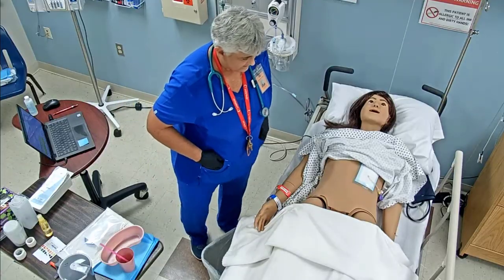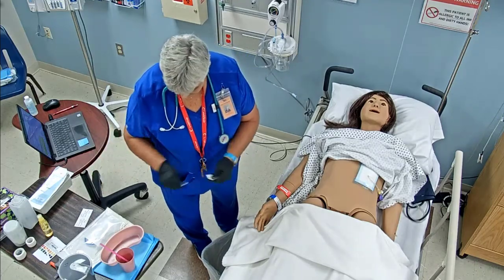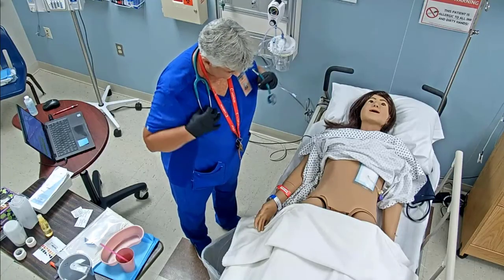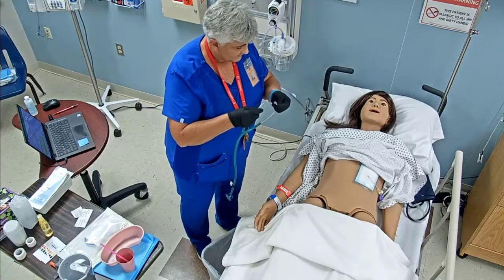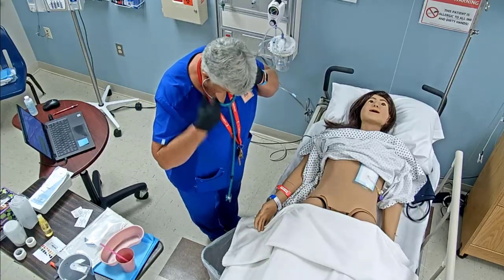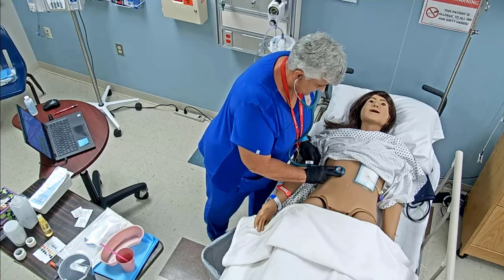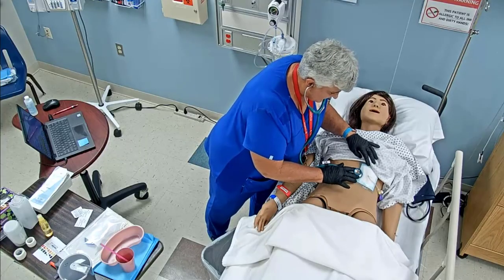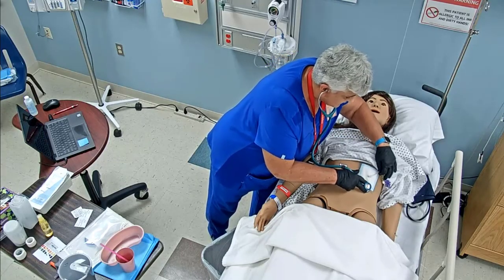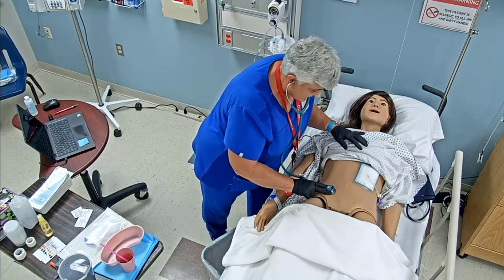with that, I'm going to go ahead and get me some alcohol swabs. A couple of those. I'm going to clean my stethoscope. So we've inspected, and I noted that you're not really having any problems breathing, you're not coughing or anything like that. We're going to listen to all 4 quadrants, making sure we look at the umbilicus as I listen. Now, I'm going to just go right next to this, still in that quadrant, because I want to be more stethoscope to skin, which is kind of hard to tell with that, but I can still at least listen in this quadrant. And I'm going to look over here in this quadrant and this quadrant.